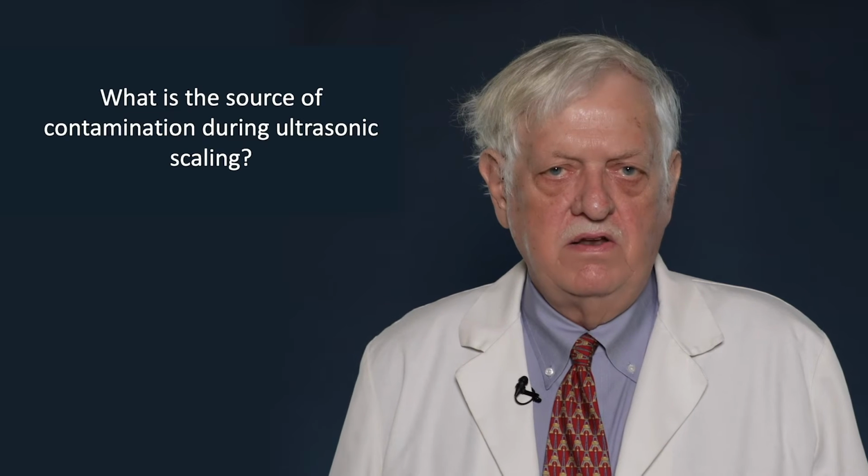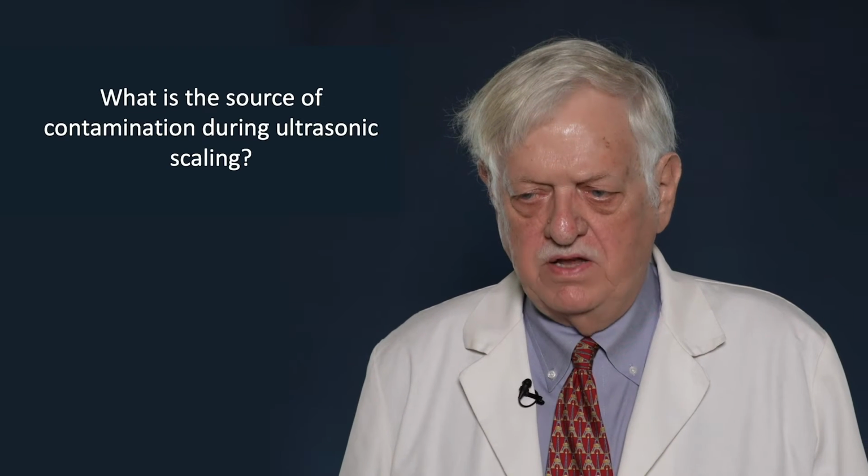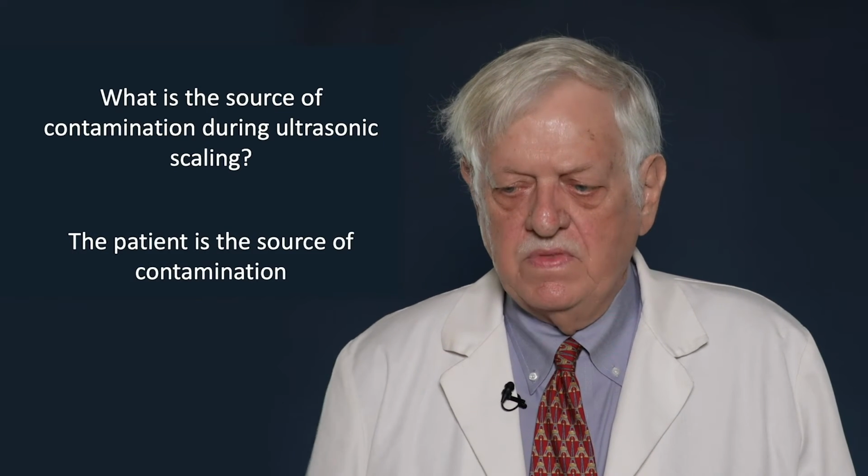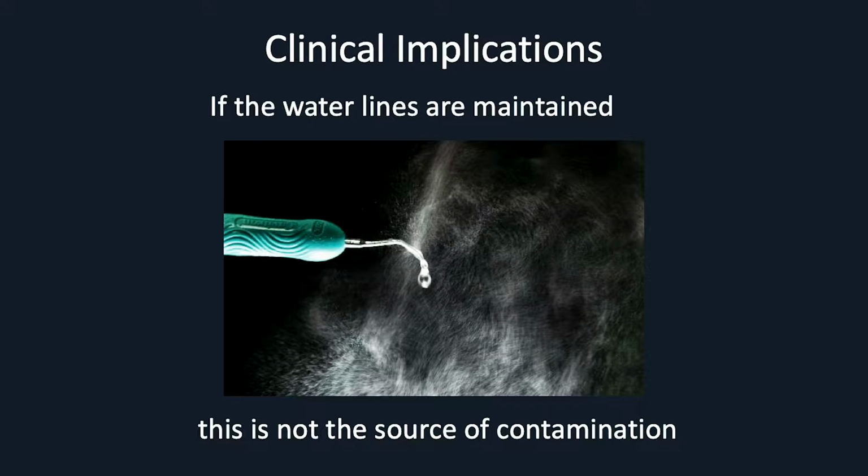The other question we need to look at is, what is the source of contamination during ultrasonic scaling? There's a very simple answer to that. The patient is the source of contamination. Now, if you take an ultrasonic scaler and hold it up and turn it on, there's this great cloud of mist and splatter. That is not the source of infection if you have maintained your dental unit water lines, which has been recommended and mandated by CDC and ADA for over 15 years. If you do that, this is not going to be a source of contamination. This should be very clean water.